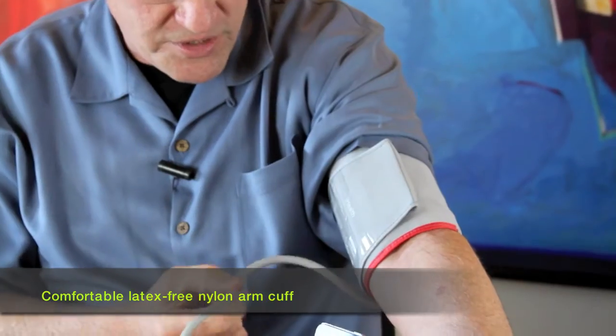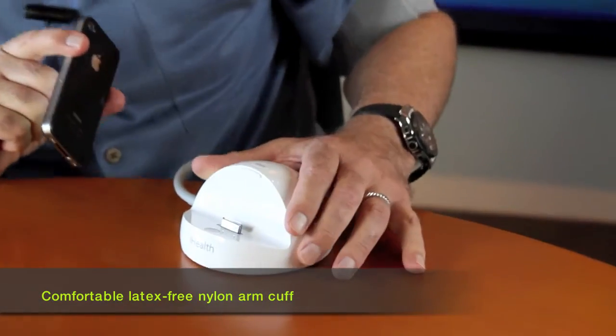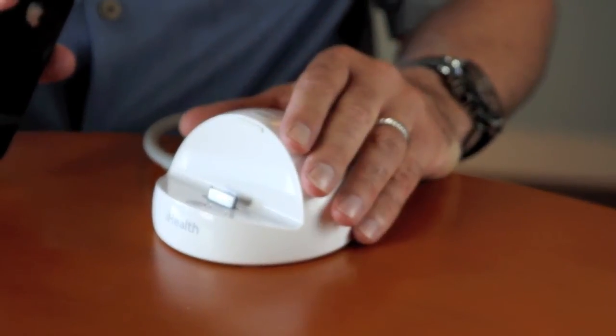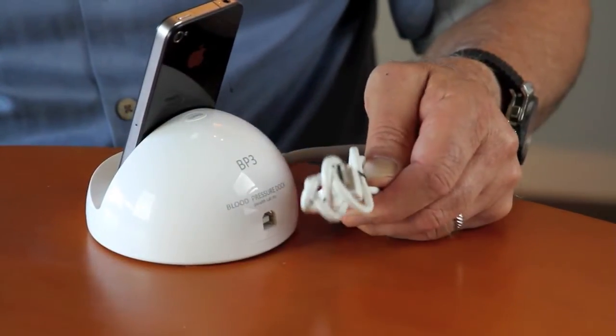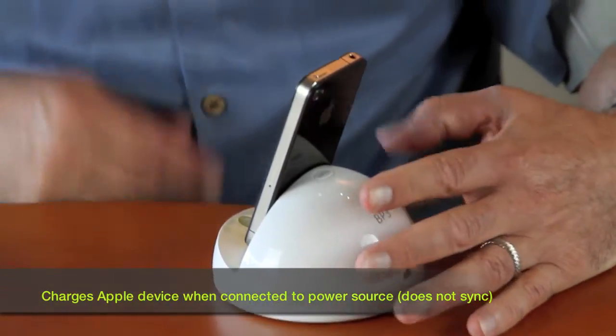A tube goes to the docking base. Come down here and look at the docking base right here — iHealth. This is a rechargeable battery-operated product. Here's the port in the back to charge this product, and it comes with a charging cable so you can charge it with any USB port or a wall charger.